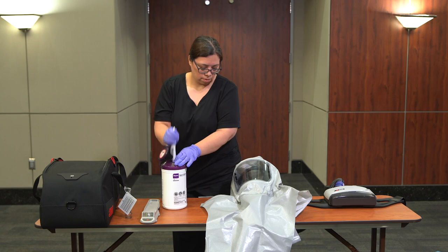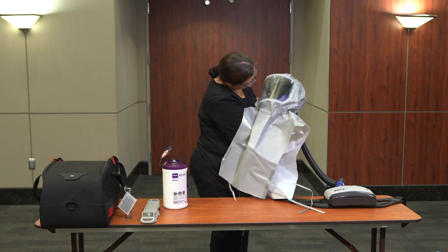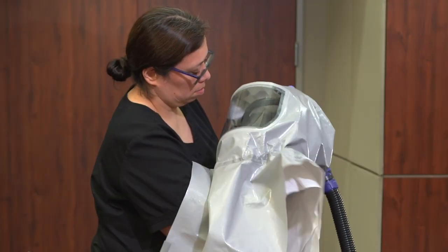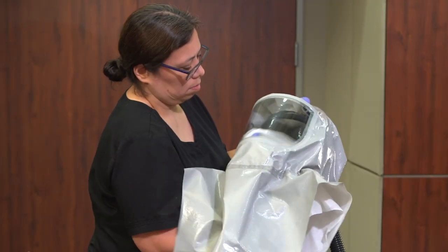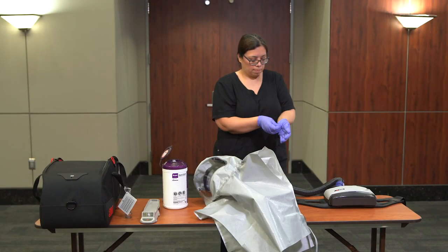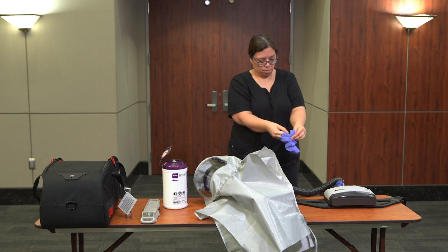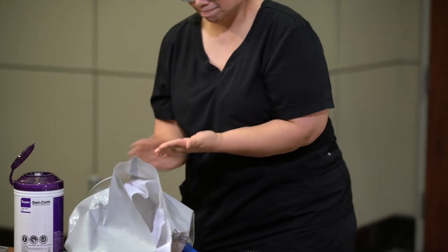Disinfect the exterior of the PAPR. Disinfect the interior head suspension and interior visor of the PAPR. Discard the wipe. Remove your gloves using glove-to-glove, skin-to-skin technique, and perform hand hygiene.